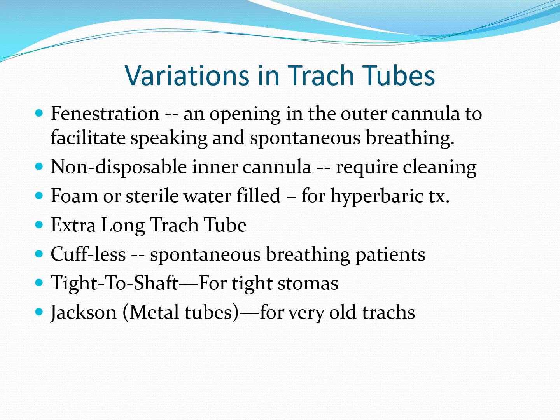Cuffless. So I alluded to this, over 90% of the tubes have cuffs, but there are some, particularly in a skilled nursing facility or even some LTACs, long-term acute care facilities, where you'll see a greater prevalence of cuffless. In a home care environment, you'll see a greater prevalence of cuffless tubes. And again, mainly, exclusively actually, for spontaneously breathing patients.